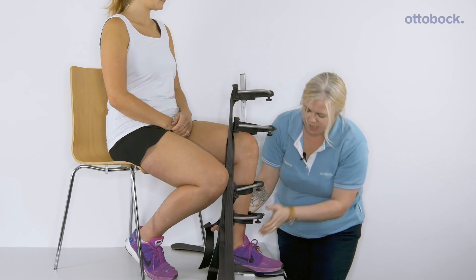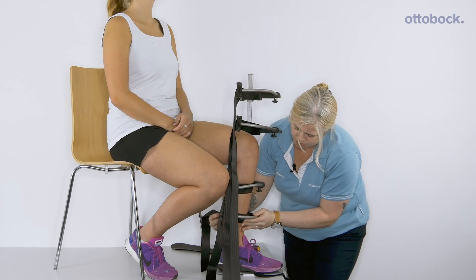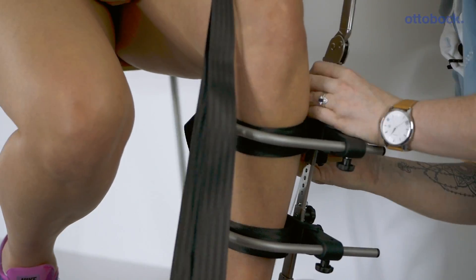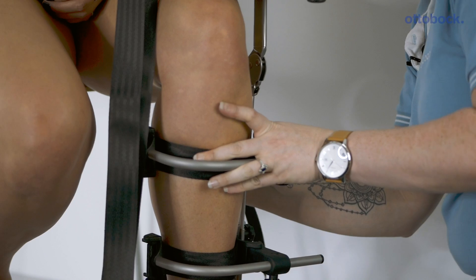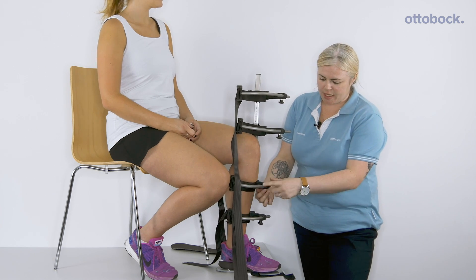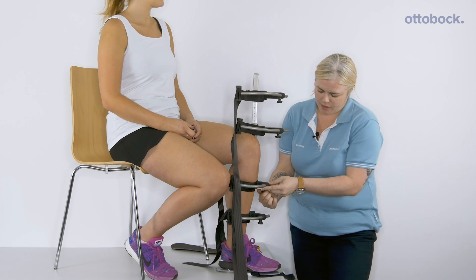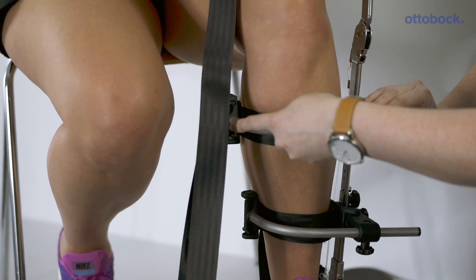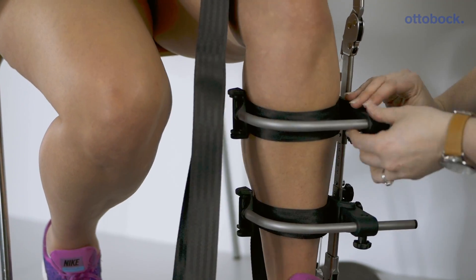These are relatively simple return straps. We would then adjust the medial lateral positioning with the screw underneath to widen or narrow the bars.